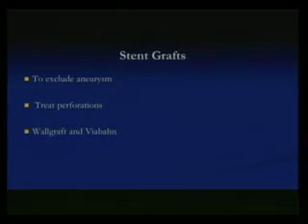So the third thing, we talked about balloon expandable stent, we talked about self-expandable stent, and the third thing is stent grafts. Stent grafts are basically covered stents. The use is to exclude an aneurysm or to treat perforations. So you have to be very familiar with these stent grafts. For example, if you get into a rupture or a perforation, if you're doing a dialysis access, sometimes you rupture the vein or rupture the dialysis access, you can bail out with putting a Viabahn.